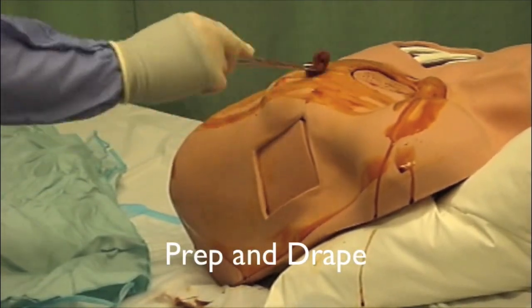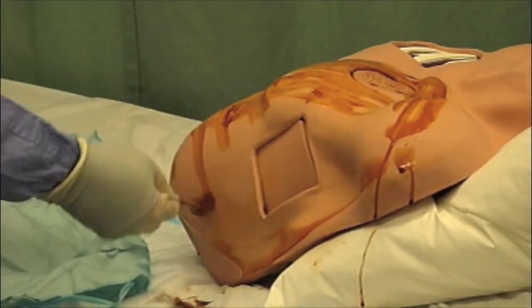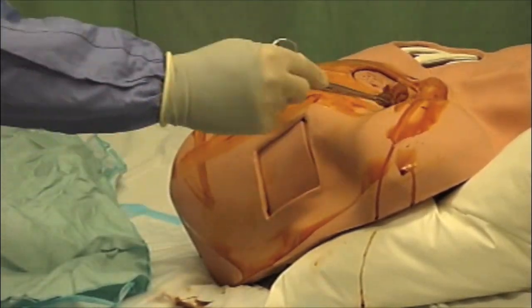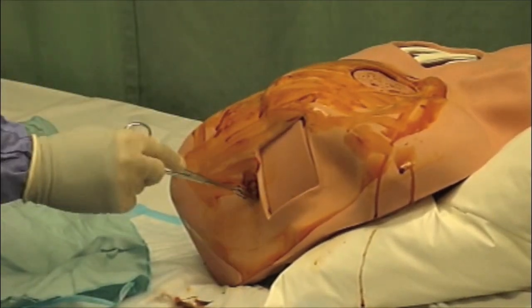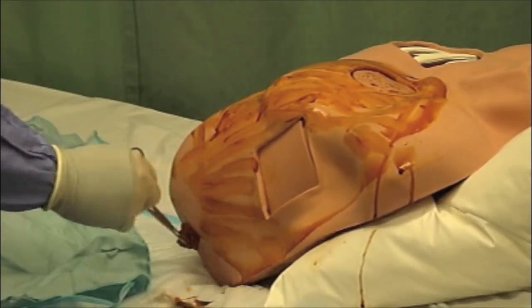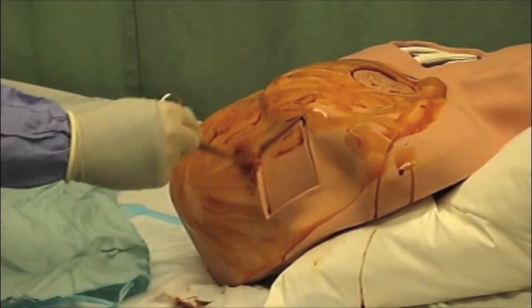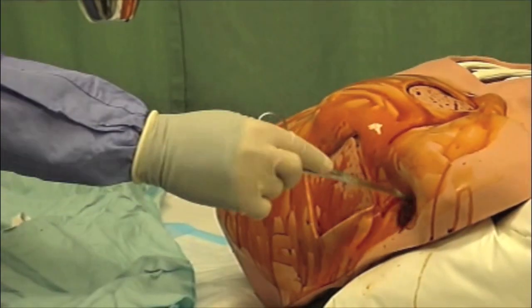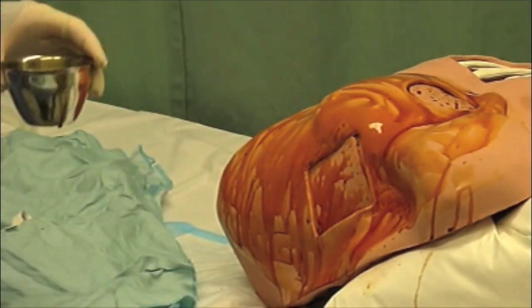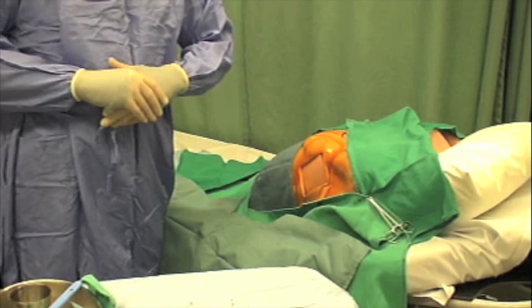Using povidone, prep a large area. Include the region from sternum to posterior axillary line and clavicle down to inferior rib margin. Remember to prep the axillary line. Prep for a total of three times. Drape the entire area.